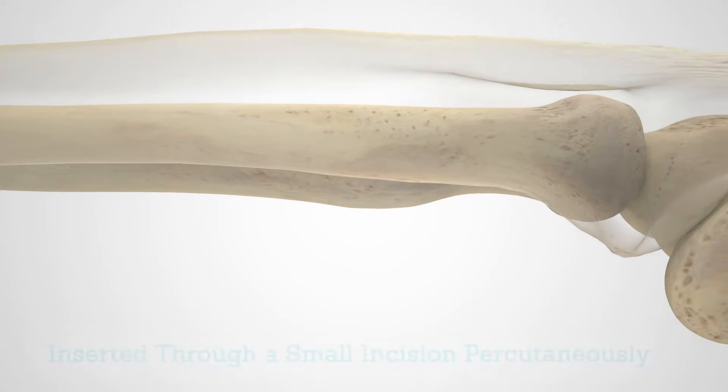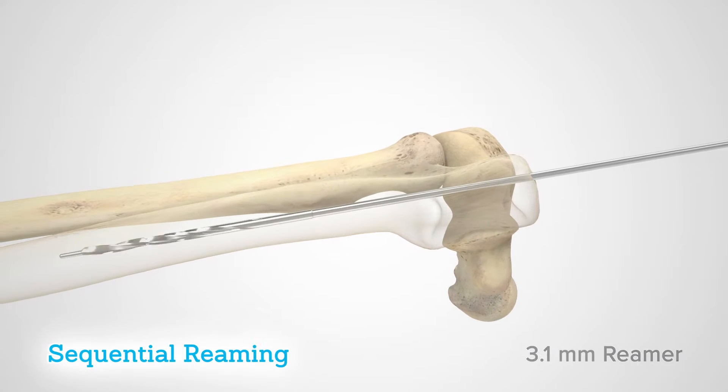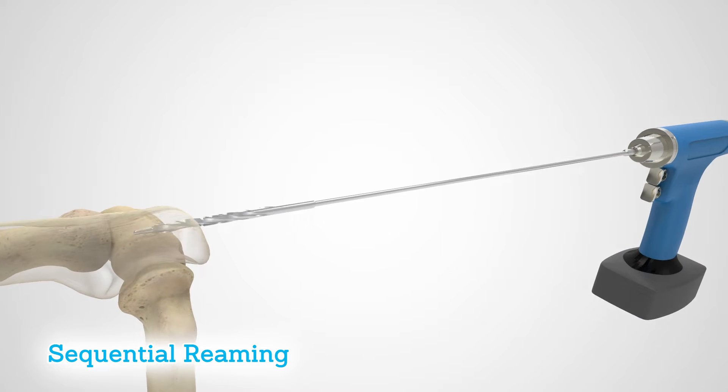Using a minimally invasive technique, the ulna nail 2 is designed to be inserted through a small incision percutaneously. Sequential reaming offers a straightforward method for intramedullary canal preparation through powered or manual approaches.